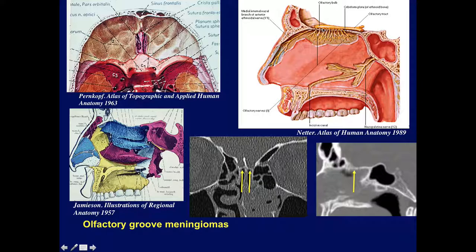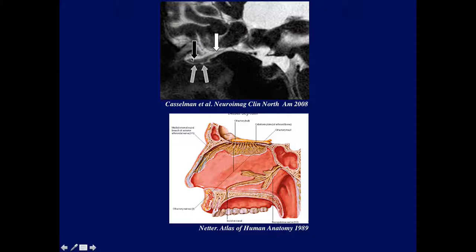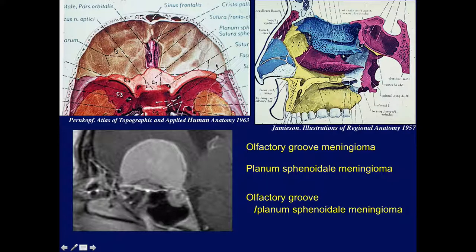Olfactory groove meningiomas arise in the region where the olfactory tract and bulbs sit, but the posterior extent is not always clear. Some people call this whole area an olfactory groove meningioma or a planum sphenoidale meningioma. On the sagittal MR, here's the olfactory bulb and tract — this is the region for the olfactory groove meningioma. A very large meningioma covering the entire floor of the anterior fossa may be called an olfactory groove, planum sphenoidale, or combination meningioma. I'll show the distinction later.